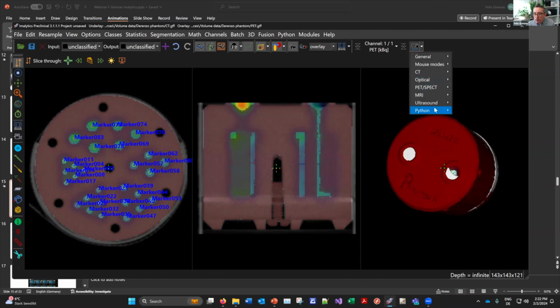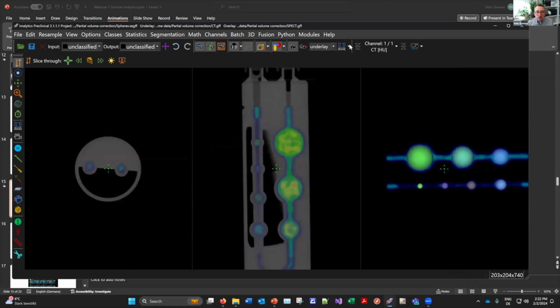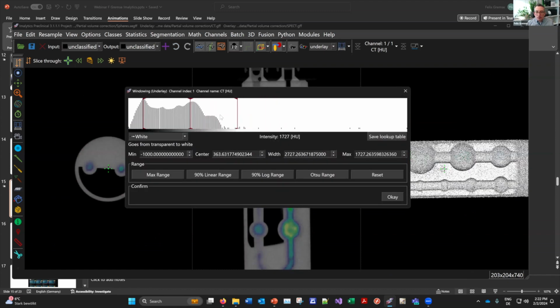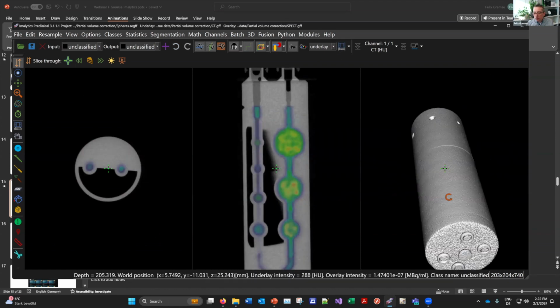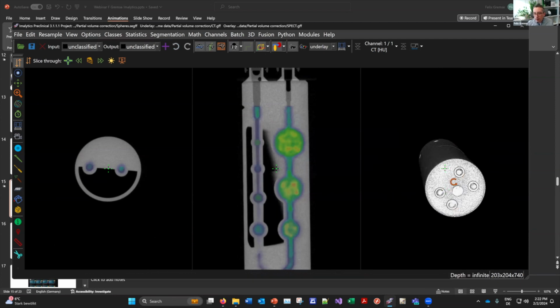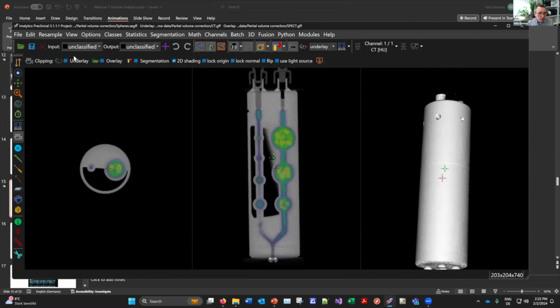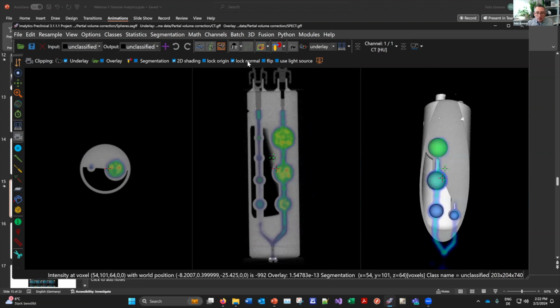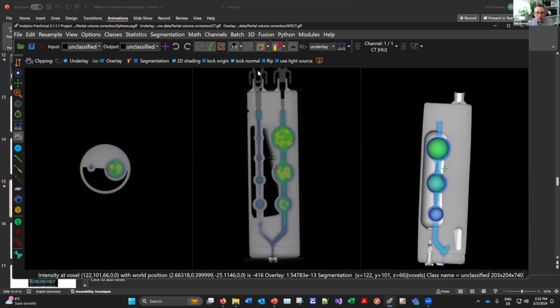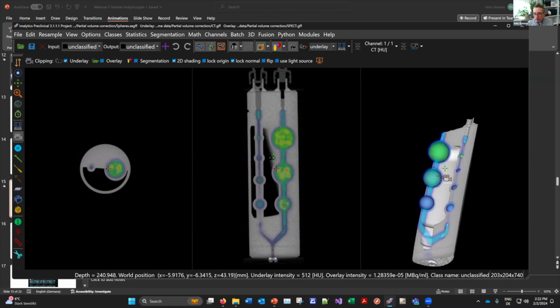We have something similar for a partial volume correction phantom here. This looks a bit different, the phantom. It's a bit longer, like a mouse roughly, and there we have the cone tips at the front at the end. And inside the phantom here, if I go through it with the clipping, you can see there are these spheres all connected, so it's easy to fill.